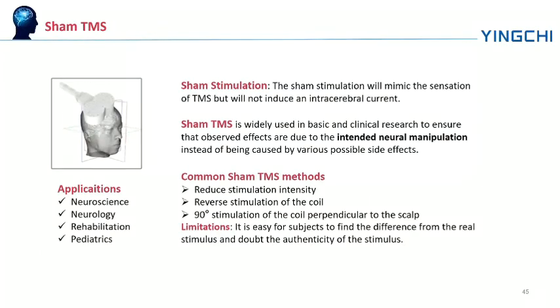So the sham TMS is widely used in basic and clinical research in many fields. It can mimic the sensation of TMS but will not induce an intracerebral current.